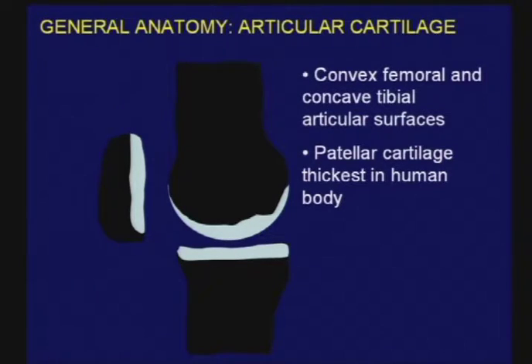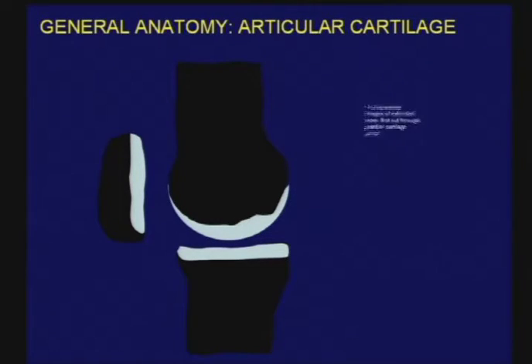So that is why most of the reports of imaging sequences used to evaluate articular cartilage have explored how good they are in the knee, and particularly in the assessment of the patellar cartilage. We evaluate this articular cartilage certainly in every knee MR examination.